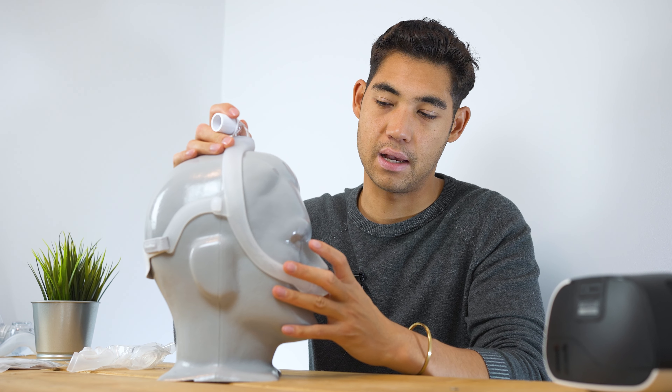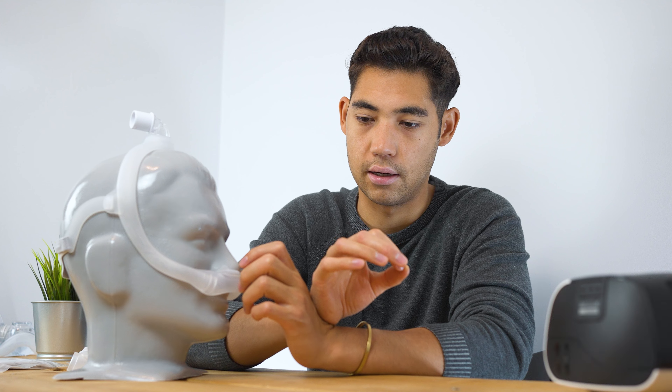I don't know if people with different shaped heads or different shaped noses love this mask. This mask sells in the thousands, tens of thousands every year, so clearly it works for some people. Just for my personal use, I noticed leakage. Please leave in the comments what you think.